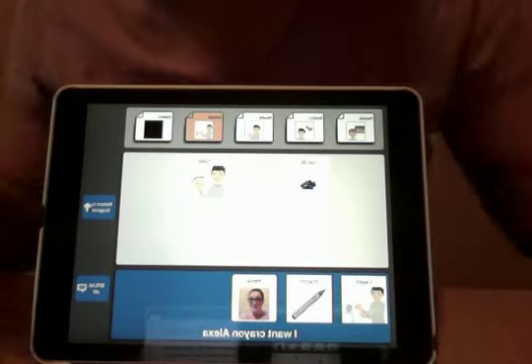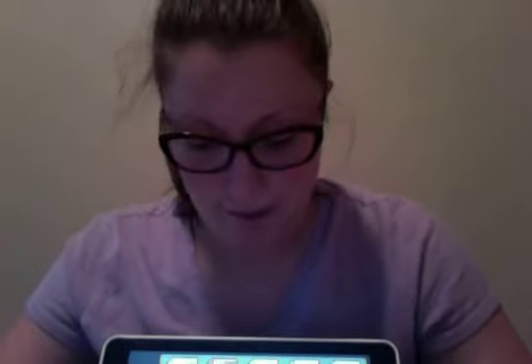Alexa. So if you were in a group setting and your learner needed to request a certain item from a specific person, obviously you could preload this with people that they come in contact with in their everyday environment. Kind of just a quick and dirty overview of SpeakAll.